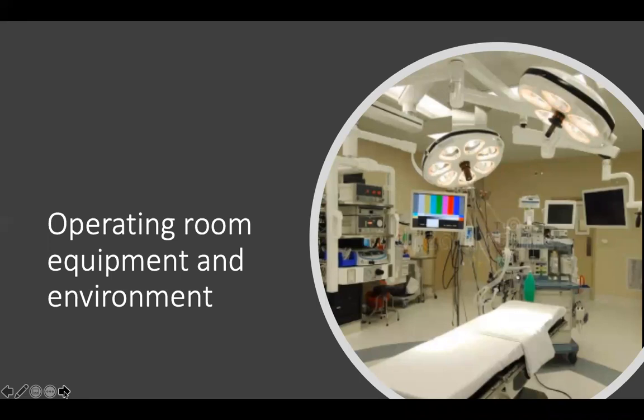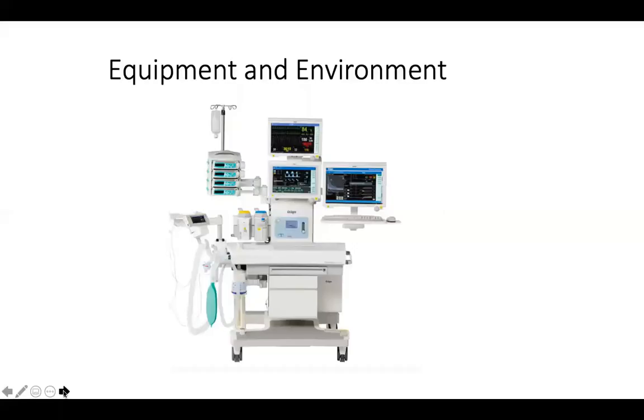Then once you've moved from seeing your patient, you now move to the operating room. So your operating room consists of your equipment that is there, your infusion pumps, your anesthetic machine, and other things that you might require. So it's very important before starting a case to check your anesthetic machine. So Dr. Folokwe covered this before, and he gave you some materials and YouTube links to checking the anesthetic machine. I will not go into depth with the anesthetic machine.